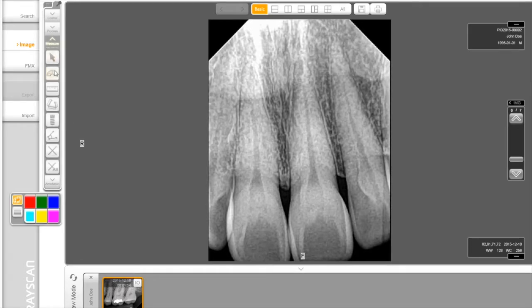Below that, you can do angles under the Measure section. You have standard single line measurements, and a single left click will start and stop. Also, you can do a multi-line or tape line, so you can do multiple measurements. Finally, you can put an arrow and draw a line in the image under Annotation. If you would like to change the thickness and color of the line, click the option as shown. Also, you can do polyline and free drawing. And you can put in some text.